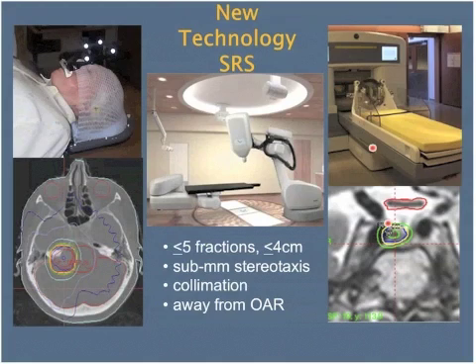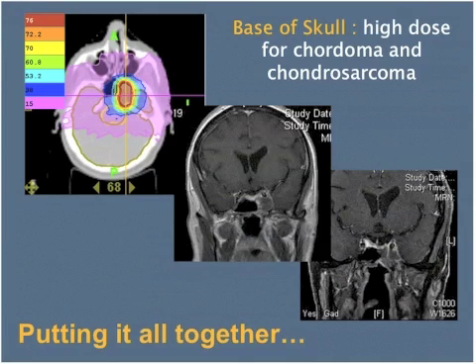In this case, a gamma knife treating a residual pituitary adenoma with some distance between the chiasm. So all of these technologies available for radiosurgery are characterized by the need to restrict to smaller lesions that are sufficiently away, or at least not invading organs at risk, and typically treating with 1 or maybe up to 5 fractions. So you put this all together, and here's a patient with a chondrosarcoma of the cavernous sinus clivus region that I treated using our tomotherapy.